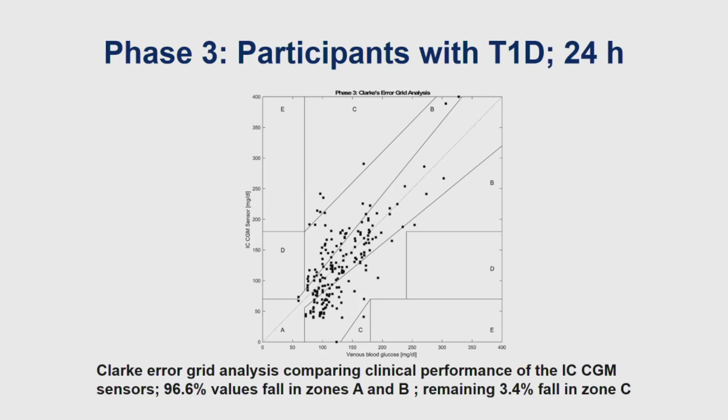And then when you plot all of them without the AI, you can see that your Clarke error grid looks very much scattered. If you compare that to the one that was shown this morning by Khalid, wherein you have that line in the middle here, ideally you would like everything to stay along this particular line. And look at the way the Clarke error grid is designed. There is some margin of error, more in the high concentration region. So this is your concentration, from 0 to about 400 milligrams per deciliter. This is the range you have. It goes from very broad, and it starts to funnel in. It's like a funnel shape.